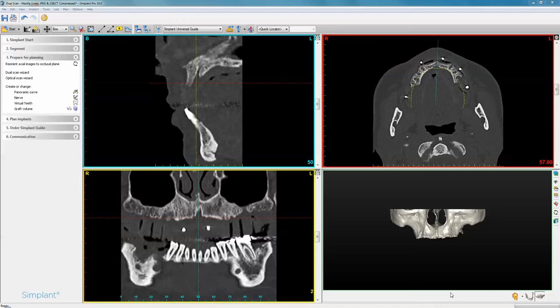The denture is radiolucent, but that is not an issue. We need it to be radiolucent because we need to identify the beads and the pattern of where the beads are placed. Those patterns between the two DICOM images will overlap each other and create a successful merge of the files.